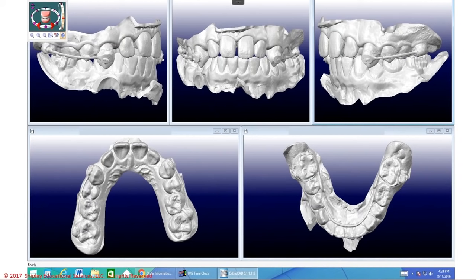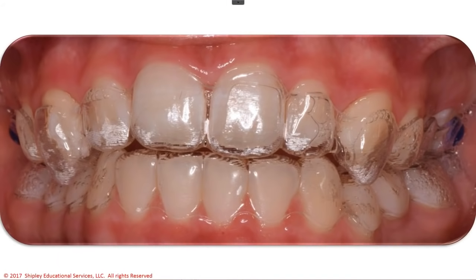Well, in this case, I told the patient to come back 2 weeks later. We expedite these cases, by the way. I told her to come back 2 weeks later, and she disappeared for 2 to 3 months, and we tried to put the aligners back in. So now we've got a problem. What are we going to do? She can't even get the aligners to fit. It's hurting. So what's the option here?